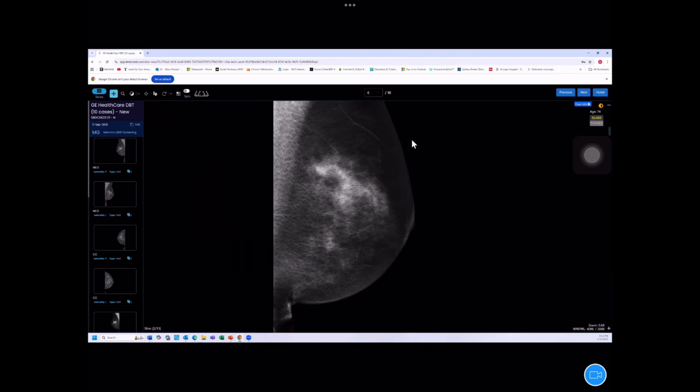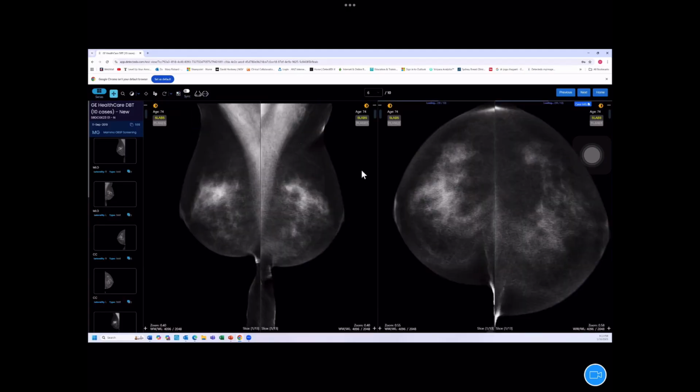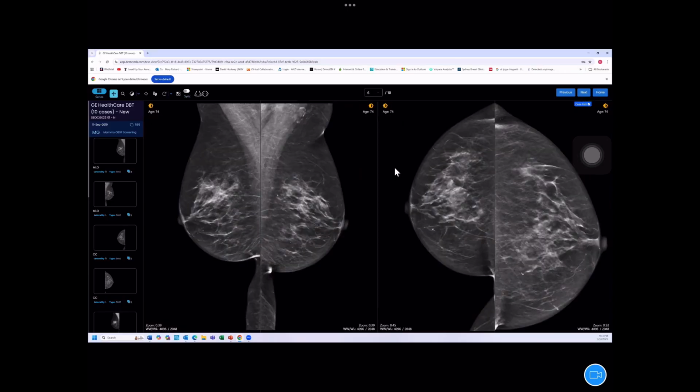Yeah, the slab's working. I don't know why I got a little bit stuck there, but anyhow it did. We're going to have a look at it here. We suddenly come into what is an obvious mass. So that's actually hard to see, right? Until you get to the actual slice, this is a hard tumour to find. It's a little irregular, finely spiculated tumour. So not an easy cancer to find.